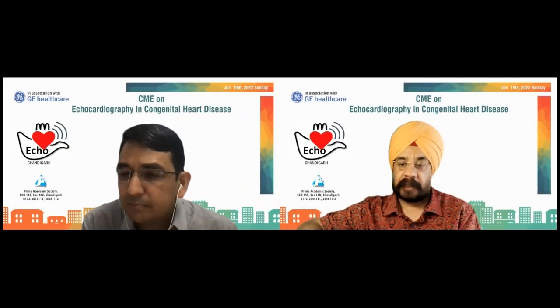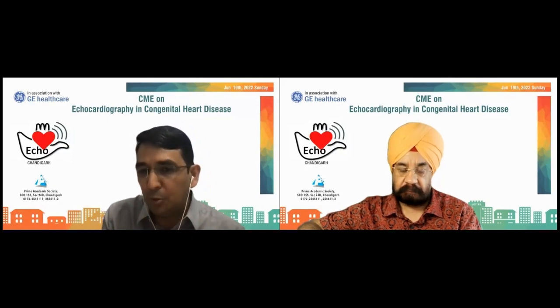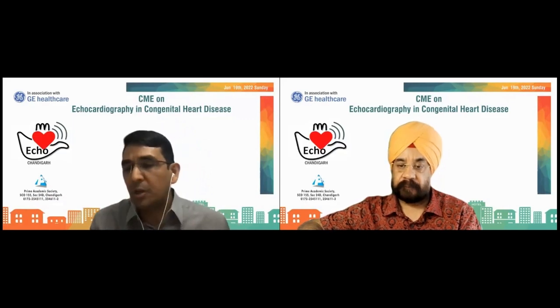Have you tried three-dimensional, and does it help? There are a couple of doctors who are working on DORV with 3D. For a simple DORV with subaortic VSD, it doesn't really make any difference, because surgeons would be able to close it anyway. When it is complex, yes, it becomes important. So we are talking about complex DORVs, not TOF-like DORV.